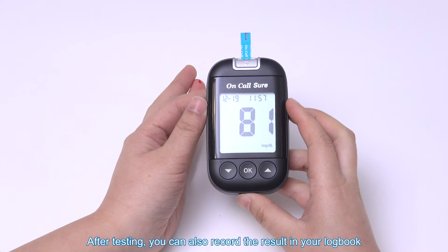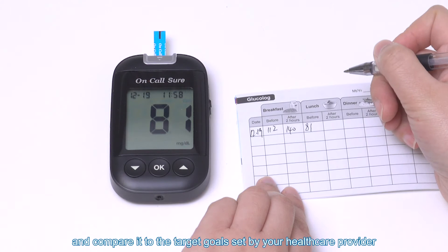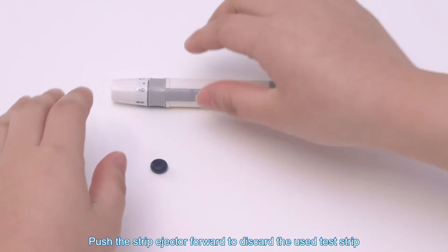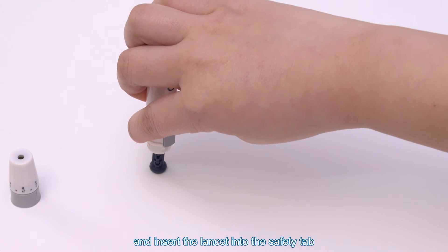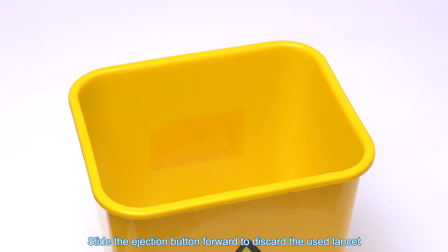After testing, you can also record the result in your logbook and compare it to the target goals set by your healthcare provider. Push the strip ejector forward to discard the used test strip. Unscrew the lancing device cover and insert the lancet into the safety tab. Slide the ejection button forward to discard the used lancet.